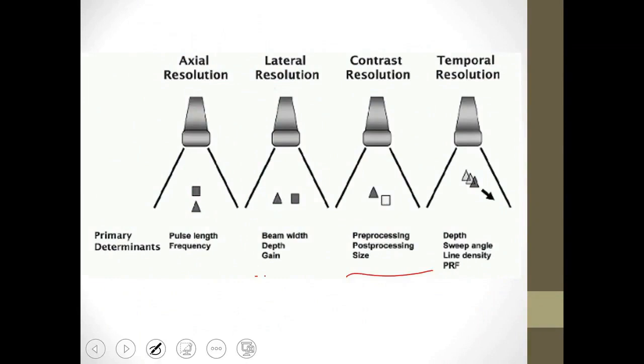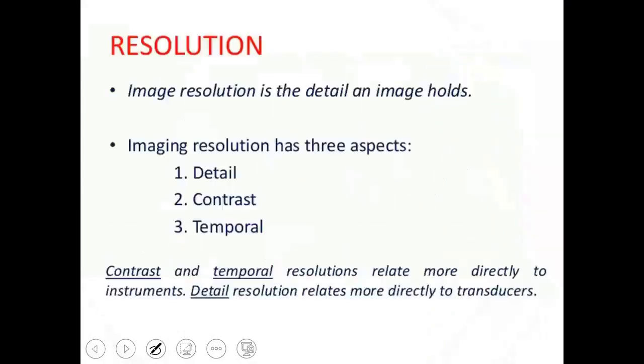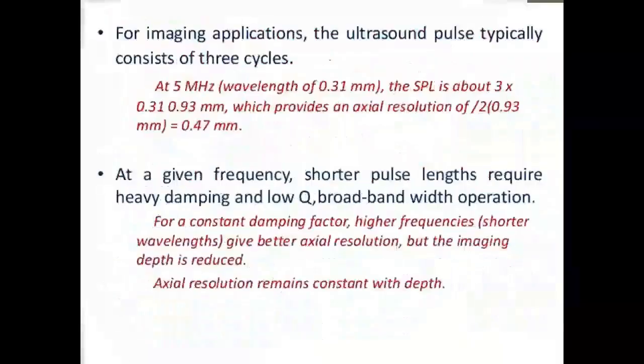This is the fourth type of resolution, which is, in essence, temporal resolution. Temporal means something related to time, in a way that something moves over time, and you want to accurately detect its motion, for instance, without any unwanted artifacts and with the appropriate level of resolution.